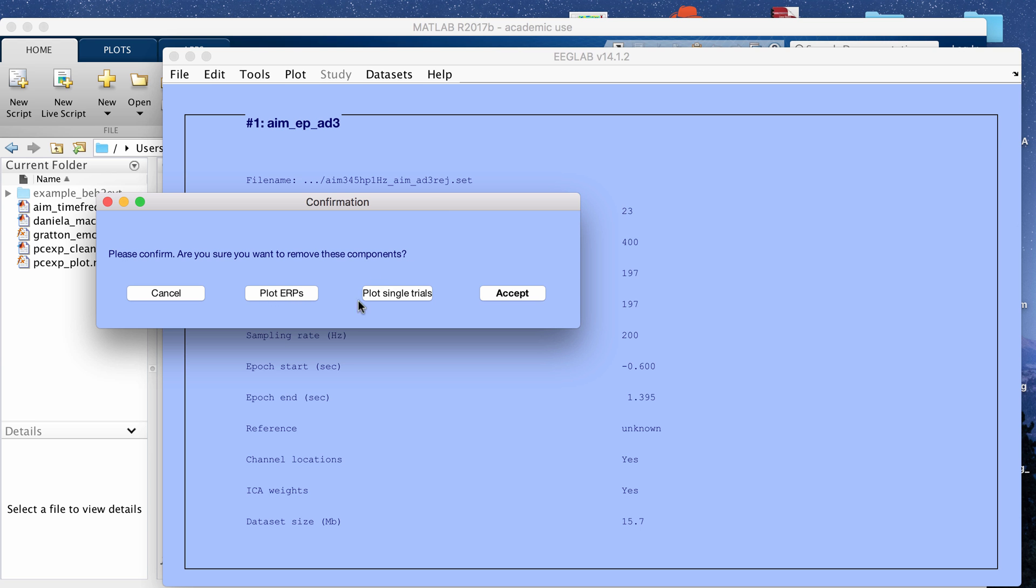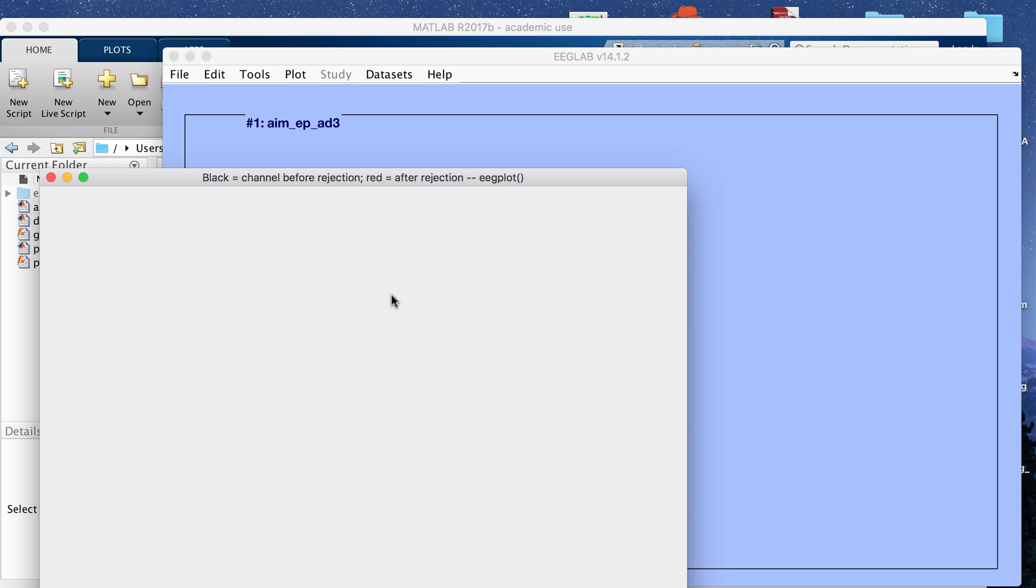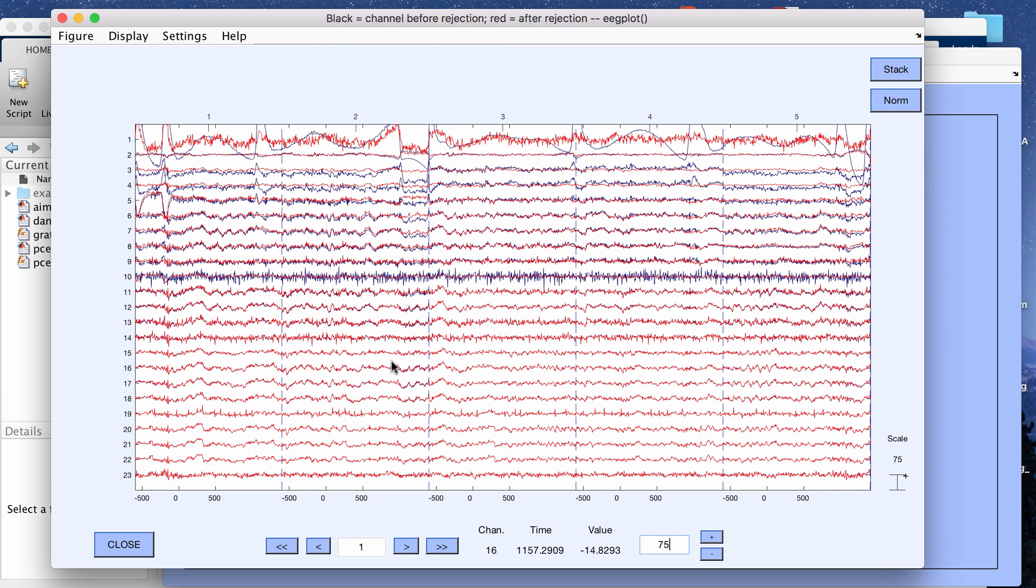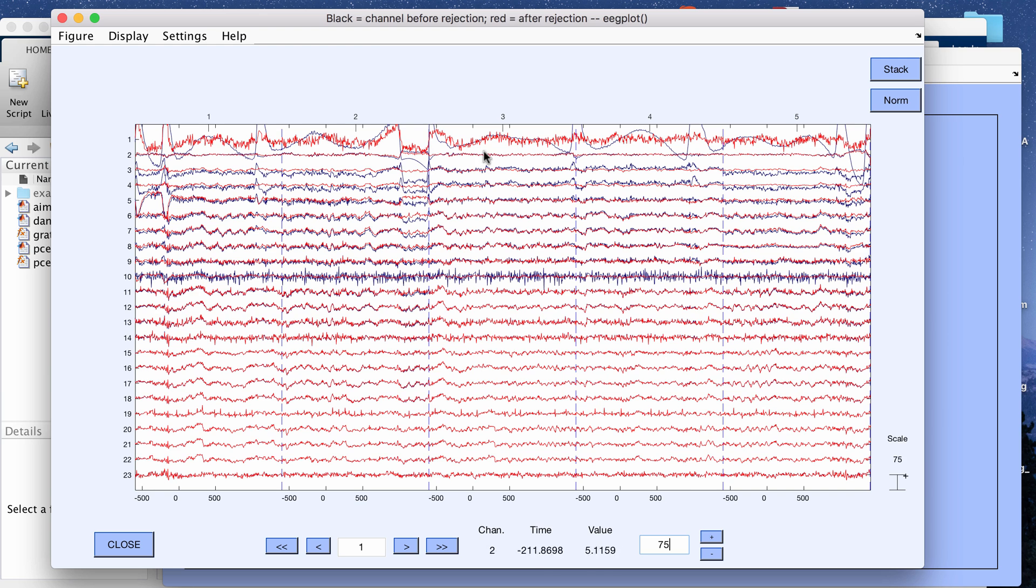You can either plot ERPs or plot single trials. I'm going to click plot single trials. It says here that the black is the channels before rejection and the red is after rejection. You can look at if it's going to change the data by removing artifact like you want it to.